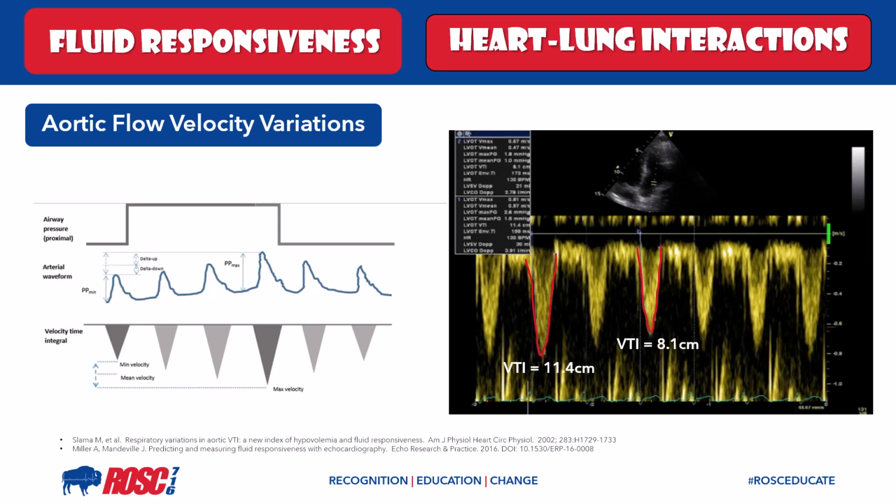From there, you calculate the difference between these two measures, the difference or the variation. Anything greater than 12% is positive for fluid responsiveness. And here you can see the aortic VTI variation is 33%. This exceeds 12%. The patient is a fluid responder.